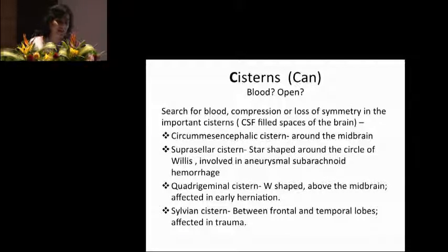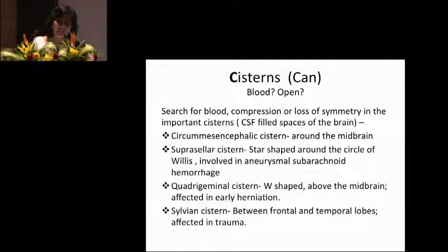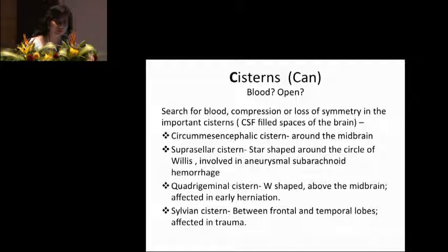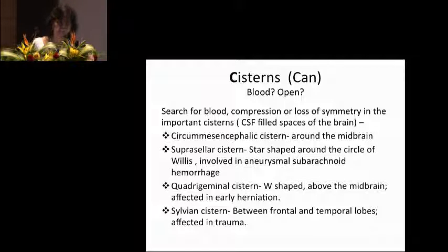C is for cisterns. Inside the cisterns we just spoke about — the circummesencephalic, the suprasellar, the quadrigeminal, and the sylvian — look for blood, which will appear white. Are the cisterns open? Are they symmetrical on both sides, or is one compressed because of unilateral pressure? The suprasellar cistern will often have blood due to subarachnoid hemorrhage. The sylvian cistern will be affected in trauma. If a cistern is compressed, something is abnormal.